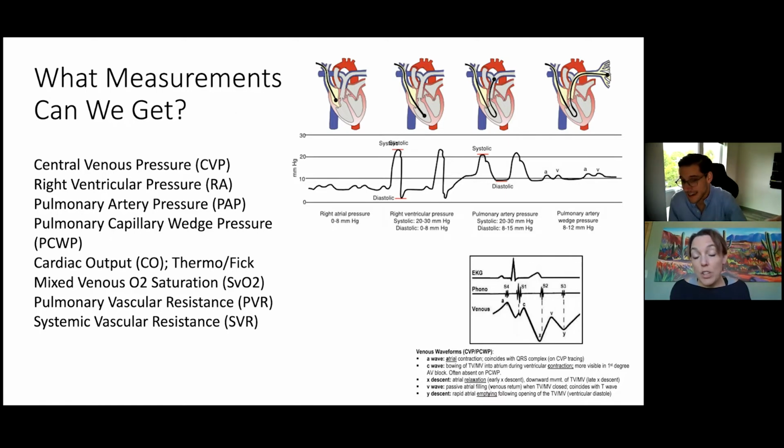very interesting, right? If I could take an aside, I guess I can because I'm the professor. I get to do whatever I want to do. This is the second video that we've recorded from this series, and in the first one, we really talked about these tracings and how they're measured. But one thing we didn't talk about in the last session that I would like to talk about here, because it's such classic teaching, is the idea of the cardiac output and how we're measuring the cardiac output by thermodilution or Fick.